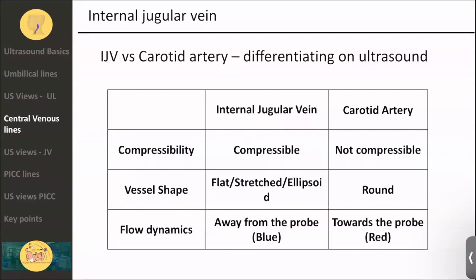So this was for the umbilical lines. In a nutshell, for the umbilical venous line, the ultrasound is very good. For the umbilical arterial line, you can just get an idea whether it is passing beyond the SMA and celiac, and that will serve your purpose. We can surely say that if after doing 50 or 100 ultrasounds you are confident, you can stop doing X-ray just to check the umbilical venous line or arterial line. Don't start doing it right after the scan workshop, but first do it in 50-100 babies. Get them screened through some of us, so that you come to know that whatever you are doing is right, and then you can omit doing the X-ray.